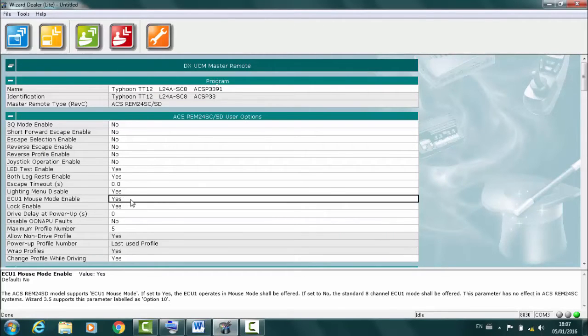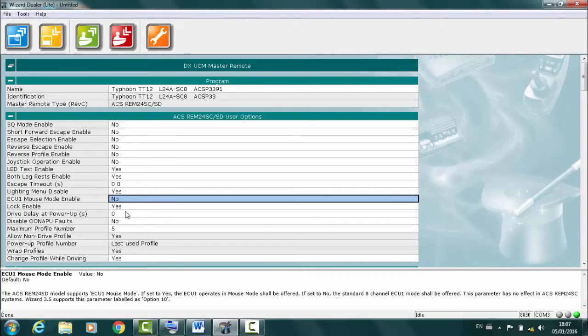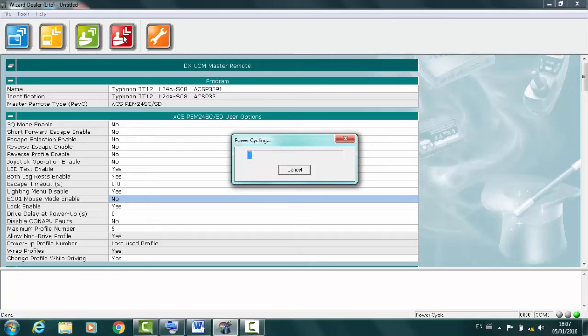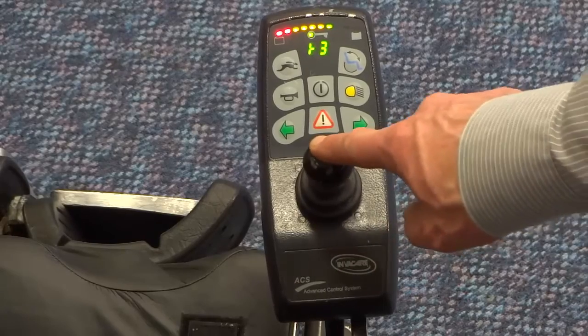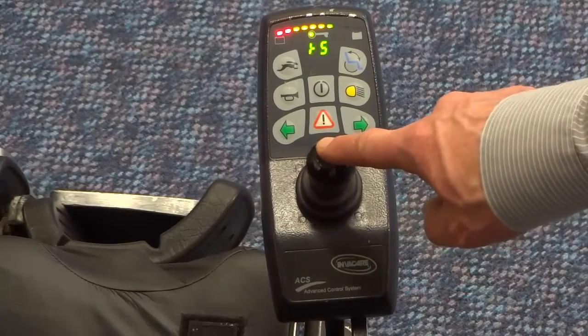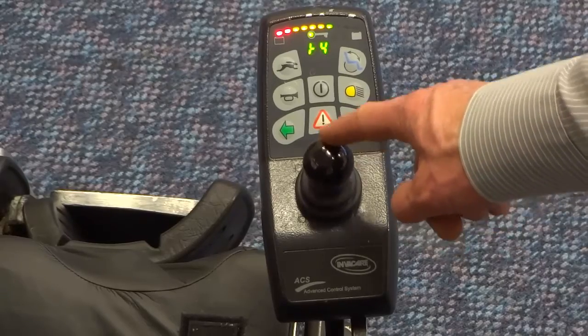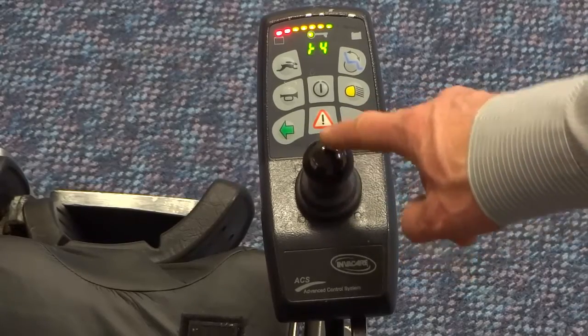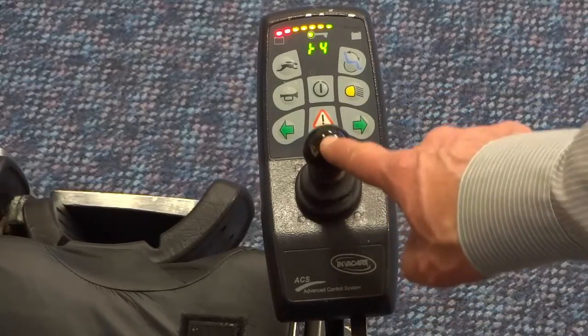Just to show the setting with mouse mode off — this is set within a controller programmer. When set to off, the DX ECU can individually control eight relay contacts. Left and right deflections will select one of eight relays, a back deflection will momentarily turn on the relay, and a forward deflection will latch the relay on.